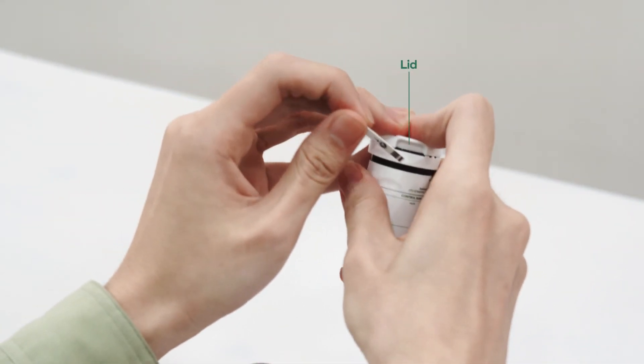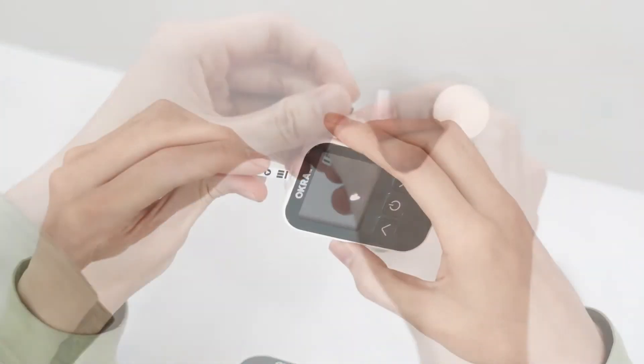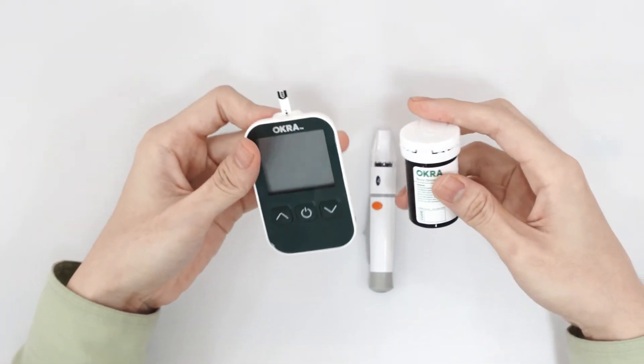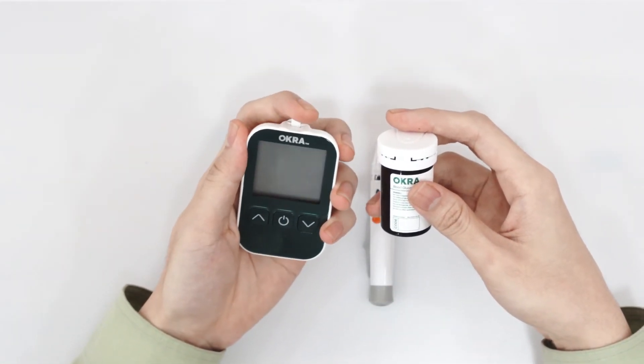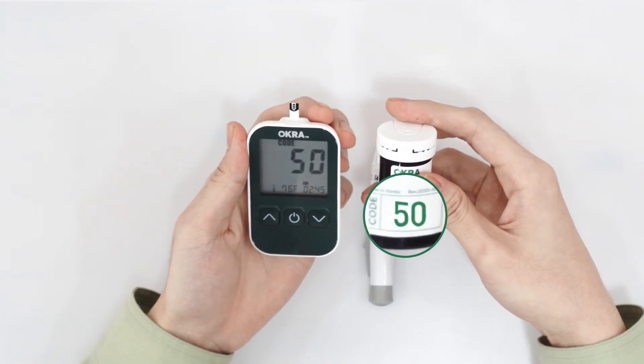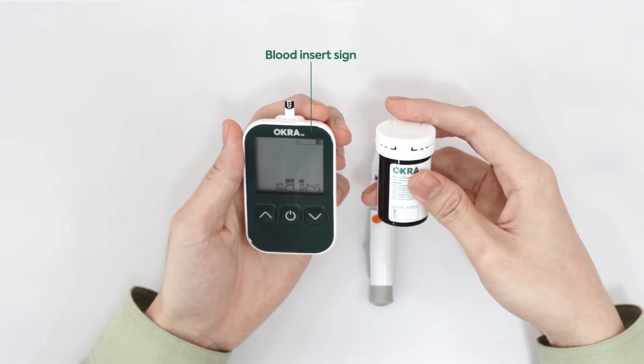Take a test strip from the bottle and always remember to close the lid tightly — this helps protect the remaining strips. Insert a fresh test strip with the arrow pointing to the meter. Once the meter turns on, make sure the display code number matches the code on the test strip bottle. Once the insert blood symbol appears, you are ready to start.